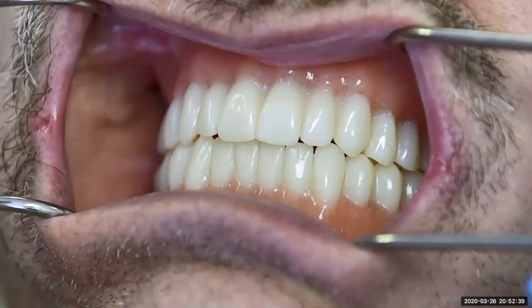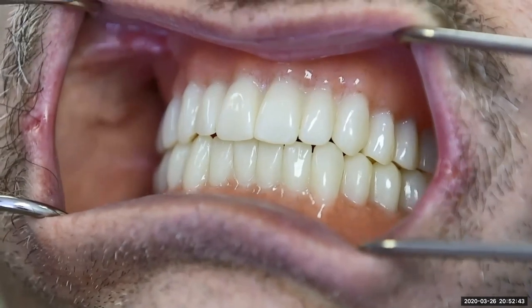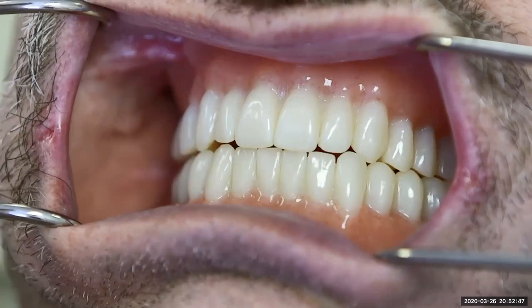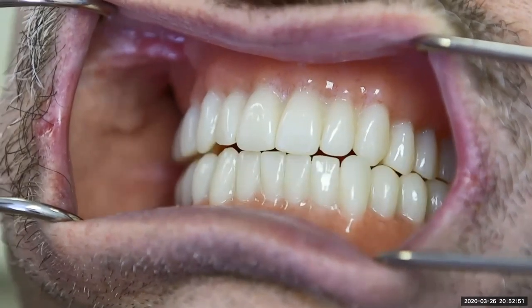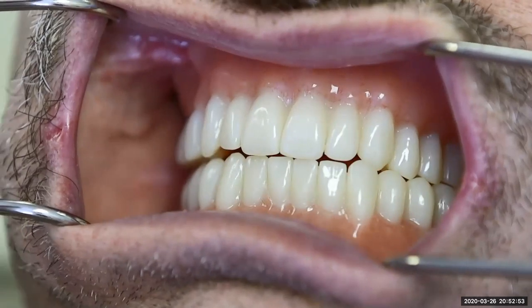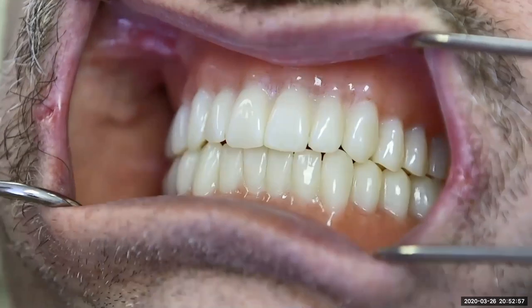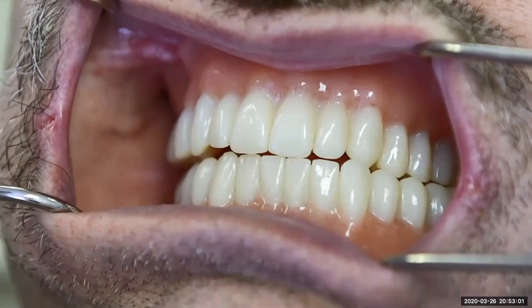Let's see if I can get the sound up for you. There we go. Now, I don't think there's any sound in here, but you can see he's asking the patient to go into excursions, going side to side to make sure the bite's correct. He's very efficient, takes a lot of time to make sure these dentures are functional and they're fitting well.